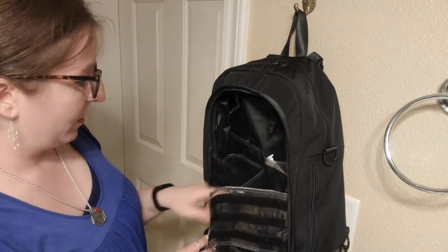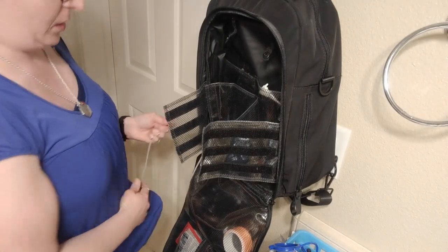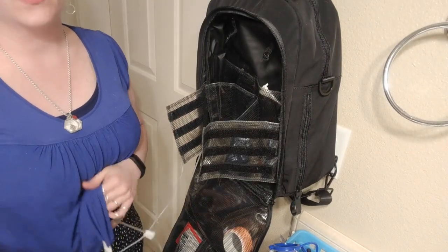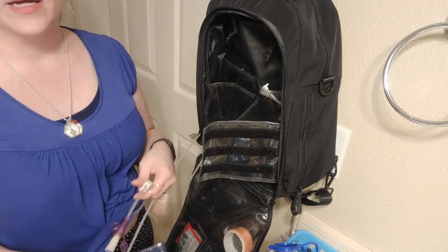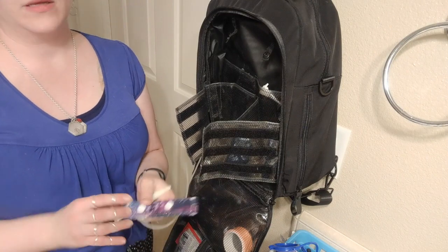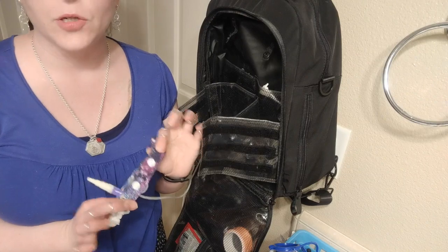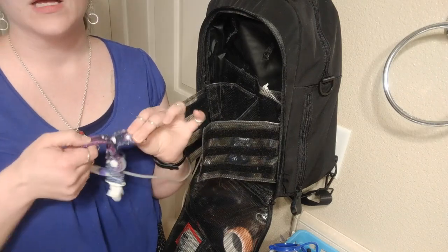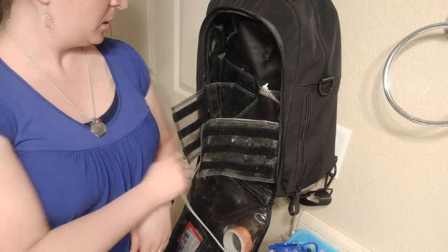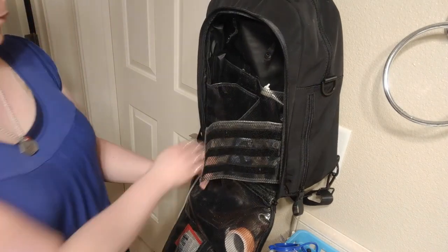So then I pull the line back through, except I am still attached. So I clamp, pull it apart, then I unclamp that from my clothes. This is called a tubey clip. They're super handy. Formula just fled everywhere. Alright. And finish one through.